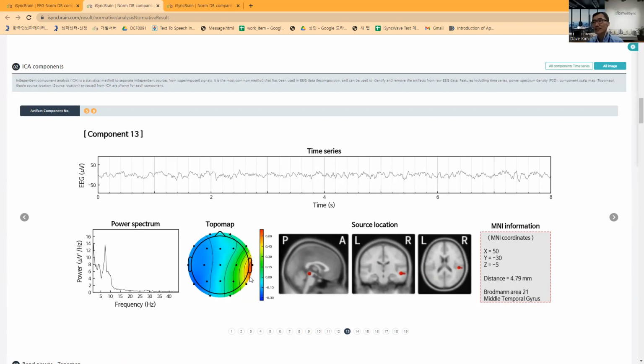Temporal slow activity is not a good sign, basically. In this case, the first major component is coming from the back of the head. In the middle of the component, there is a lot of theta activity. If the theta activity is in the first part of the component, then the symptom is worse, because the first part of the component usually has the highest power.